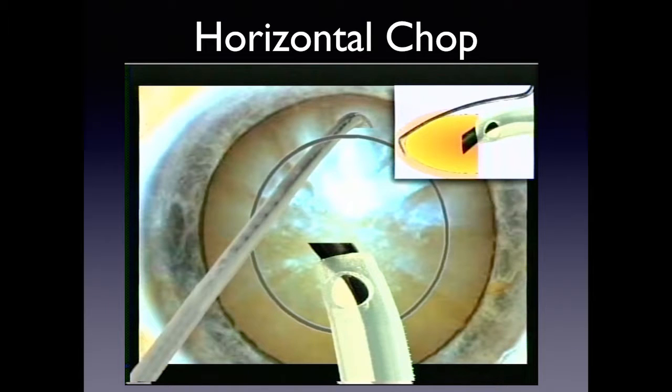There are two types of chopping. In a horizontal chop, it's important that the phaco tip is occluded. You bury the tip in foot position three, and when you hear the bell indicating occlusion, you drop back to foot position two so it's still occluded but you have control of the nucleus. Then with the chopper, you go under the capsulorhexis out to the edge of the nuclear material. The handpiece doesn't move — if it moves you'll flip off the piece. The chopper is drawn toward the occluded tip, then just before reaching it you move the instrument to the right while the chopper goes slightly left, splitting the nucleus.